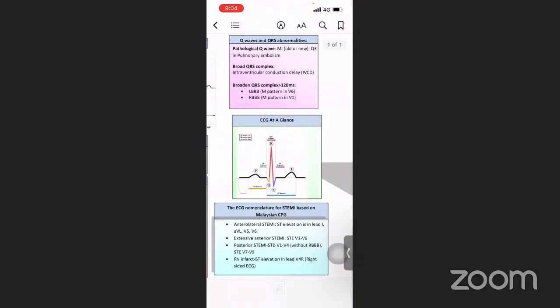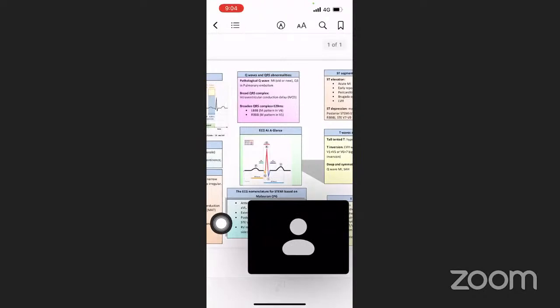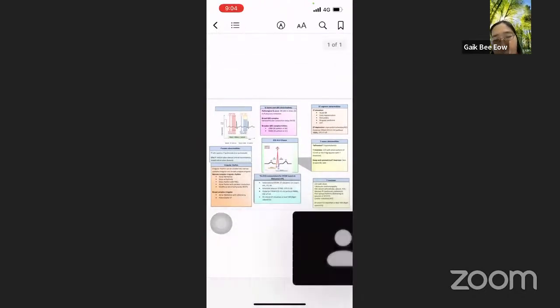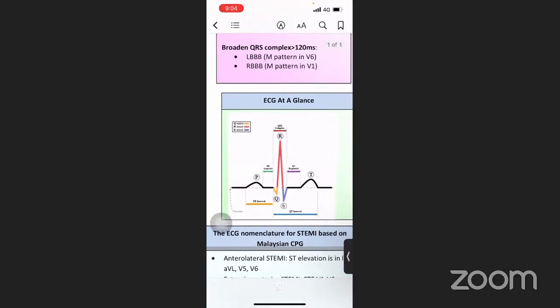Now we go to why we need to do ECG, why certain morphology is different in certain conditions, and how to interpret ECG. Is the sound okay? Yeah, all good. Okay, so this chart will share with you at a glance each component, what is meant by P.